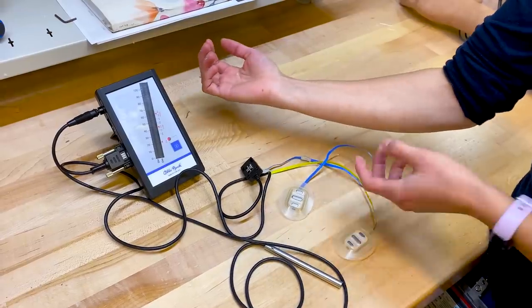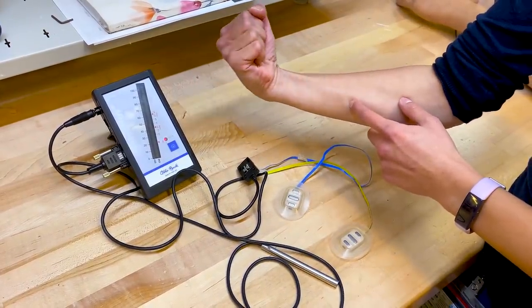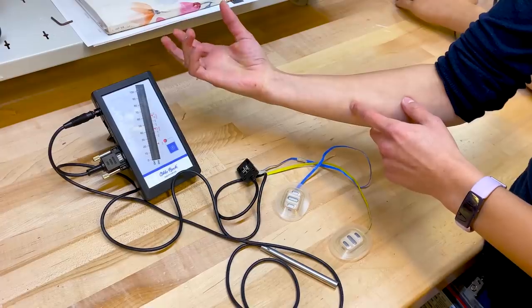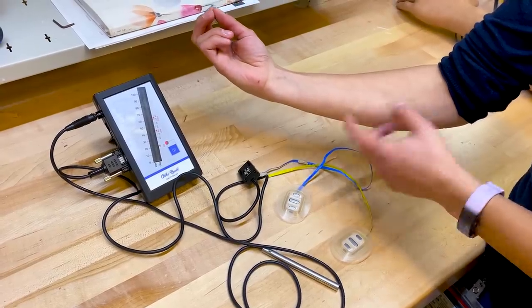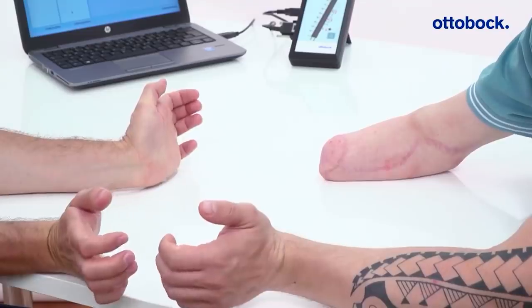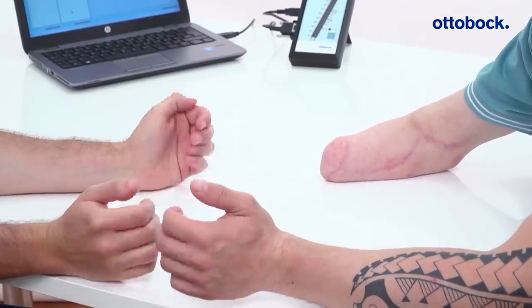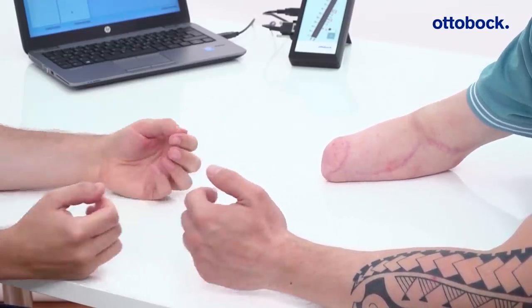So for example, with a prosthetic hand, the muscles that would normally cause your wrist to flex will trigger the prosthetic hand to close. And the muscles that would normally cause your wrist to extend will trigger the hand to open. So for patients who've had an upper limb amputation, they have to imagine that they're moving their wrist up or down in order to activate those muscles.